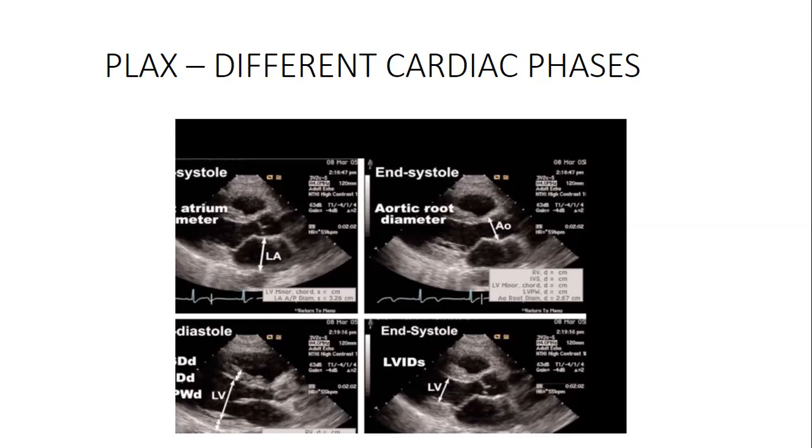You just press it, they've got numbers there, you press it up. Now, when you press it up, you are allowing this slow pulsed wave Doppler, which is sending and receiving, the signal is being sent and waiting. So you are just trying to enhance its analysis of the pulse that is being sent.